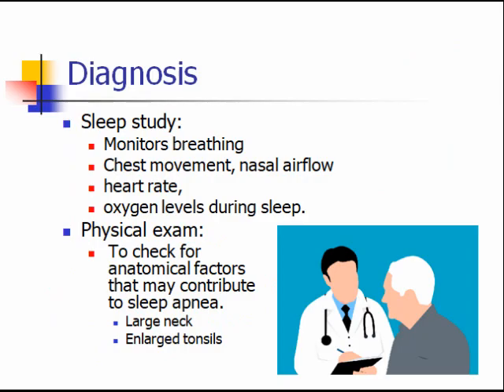Those symptoms are helpful in cueing us in that we may need to have an official diagnosis of what's going on. And so one of the best ways is a sleep study. And this monitors our breathing during the night. It measures chest movement or nasal airflow. It records our oxygen levels during sleep. Also, it monitors our heart rate.